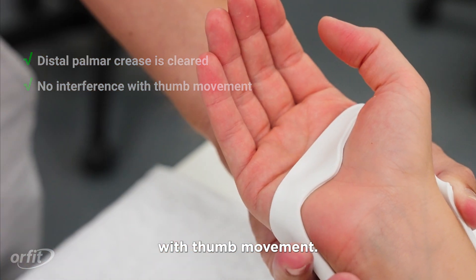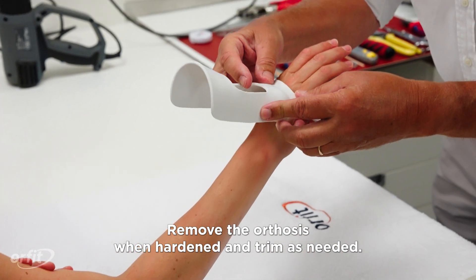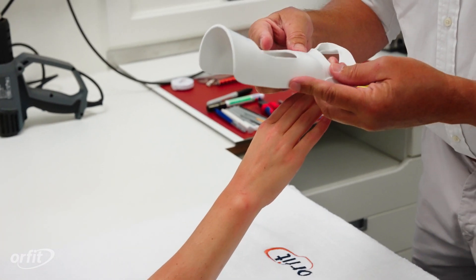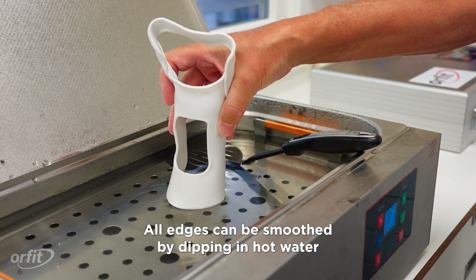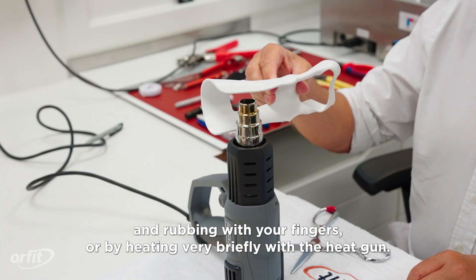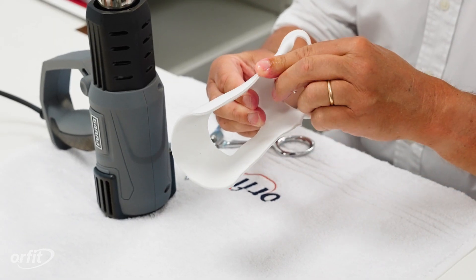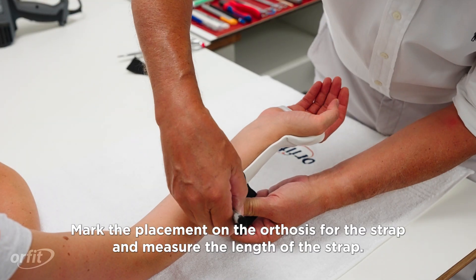Remove the orthosis when hardened and trim as needed. All edges can be smoothed by dipping in hot water and rubbing with your fingers, or by heating very briefly with the heat gun.